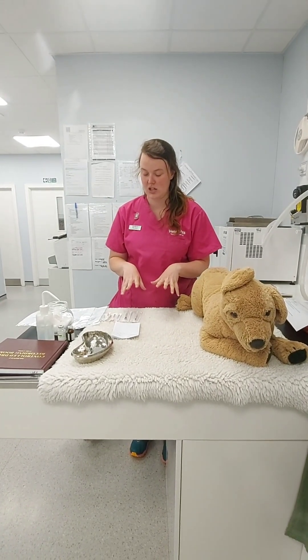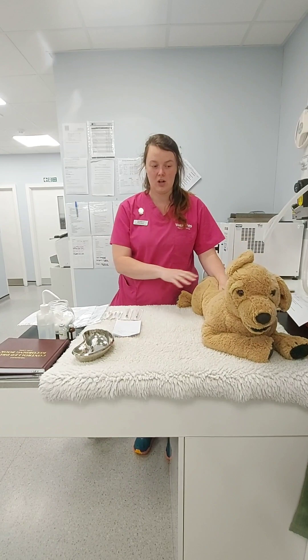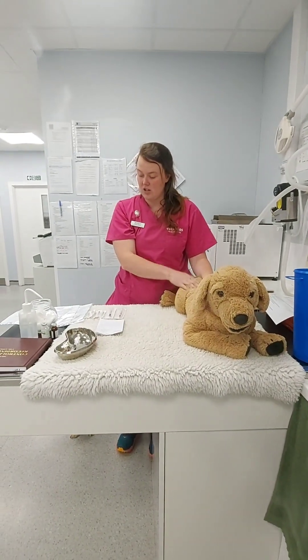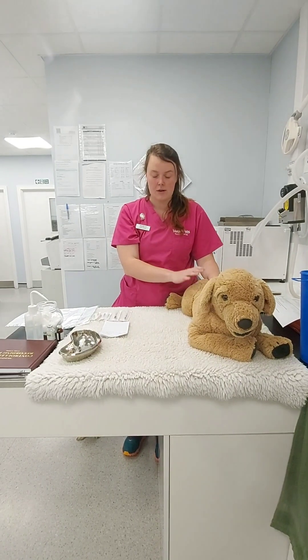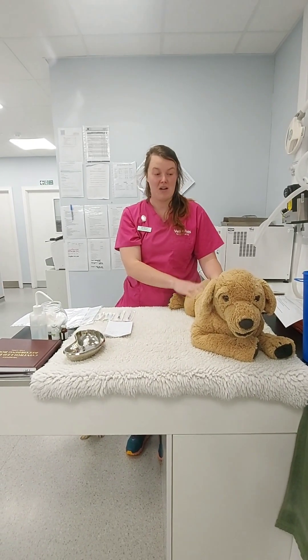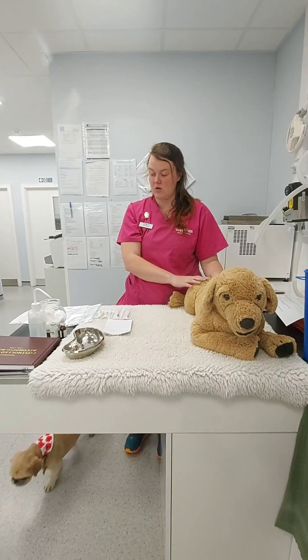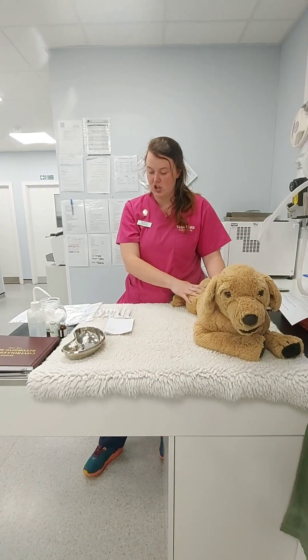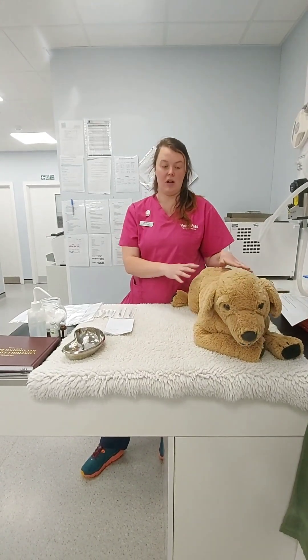We'll start by calculating our dosage. For your patient — we're going to use Rover, a 20kg dog — your scenario is that you'll have the weight given to you. We're going to be giving methadone, so we'll do the intramuscular first and then quickly do the subcutaneous.